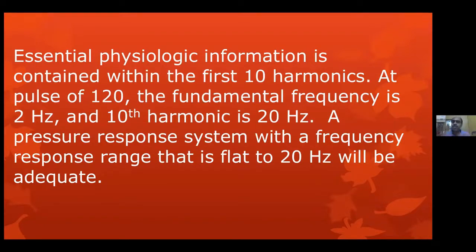In severe pulmonary stenosis, distal pulmonary artery pressure is 20. So let us assume there is a post-stenotic dilatation of the main pulmonary artery. What is the recovery? 20, 15, 18, all will be more or less the same. So the quantum of gradient: let us assume that I am having a severe pulmonary stenosis with an RV pressure of 100 and distal PA pressure of 20, I have an 80 millimeters of mercury gradient.